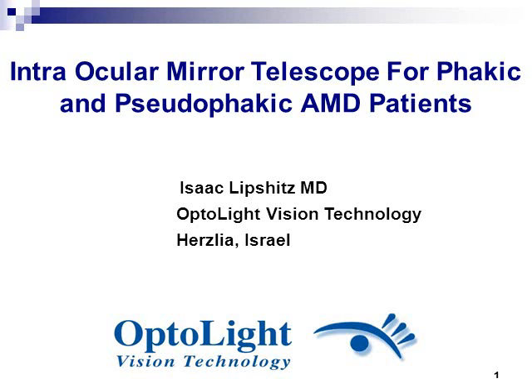Welcome to the instruction course of the secondary mirror telescopic implant, the OriLens. It is the first pseudophakic mirror telescope in the world. As you will learn, it can be used for pseudophakic as well as for phakic AMD eyes.